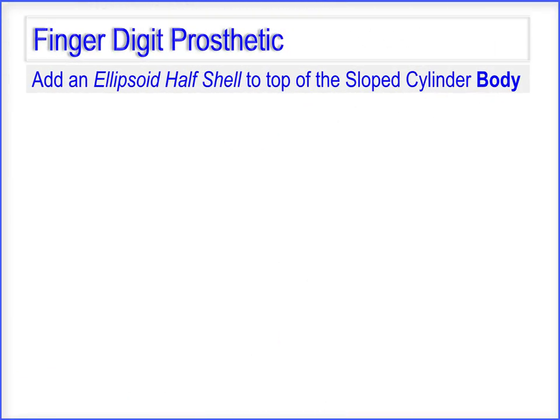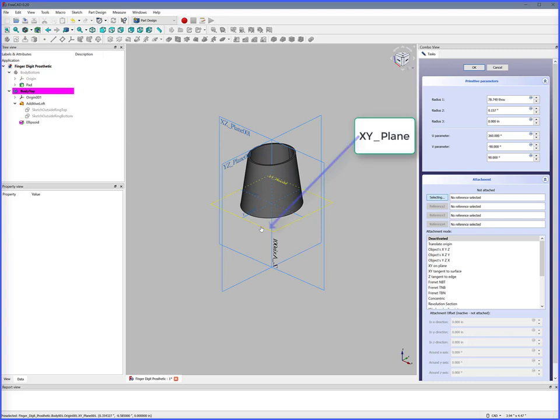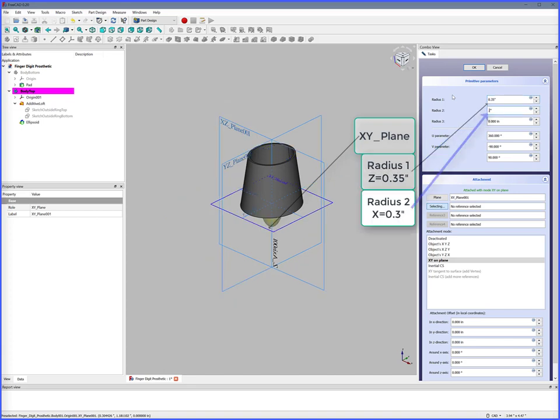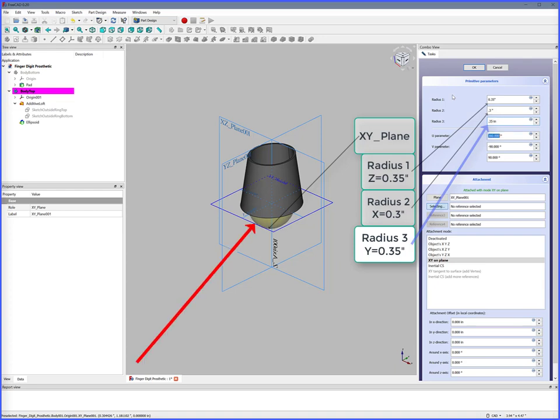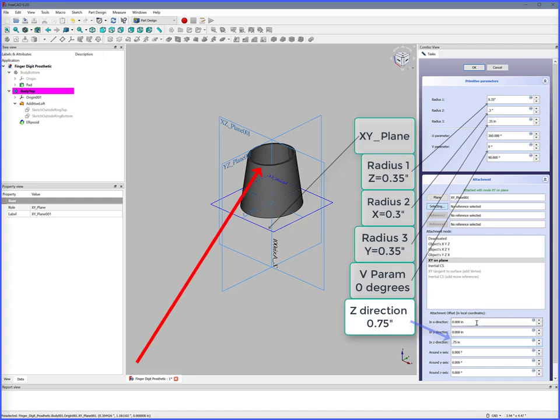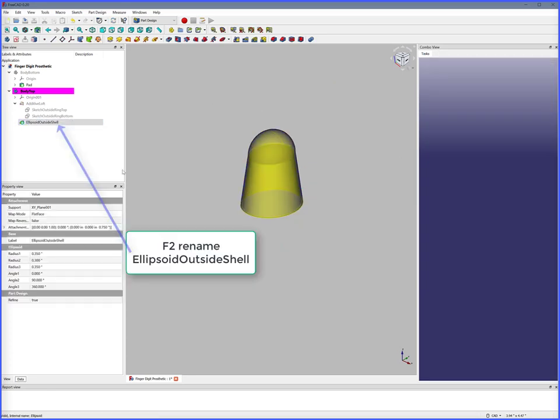Add an ellipsoid half shell to the top of the sloped cylinder body. Double click Body Top, Additive Ellipsoid, XY Plane. Radius 1 (Z axis) 0.35 inches, Radius 2 (X axis) 0.3 inches, Radius 3 (Y) 0.35 inches. See the ellipsoid projecting out of the bottom. V Param equals 0 degrees — this makes a half ellipsoid. In Z direction, 0.75 inches — this moves the half ellipsoid to the top. OK. F2 to rename to Ellipsoid Outside Shell.